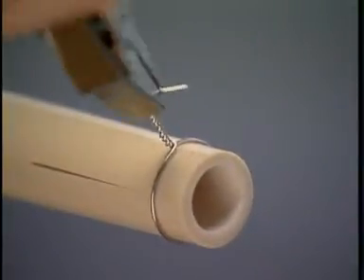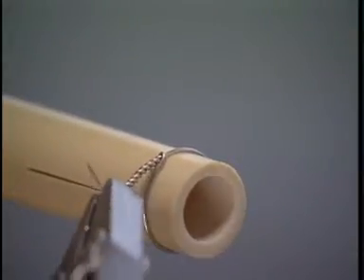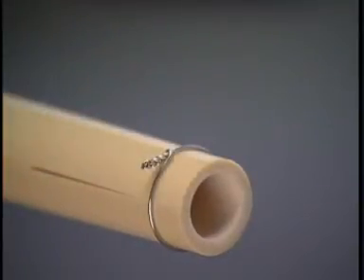To lay the twisted end of the wire close to the bone, the twisting action is continued in the same direction without any tension being applied to the wire. The excess wire is cut off, leaving three or four twists.